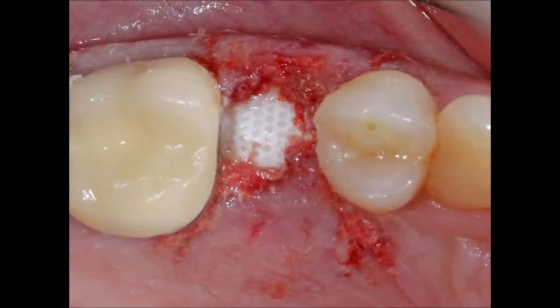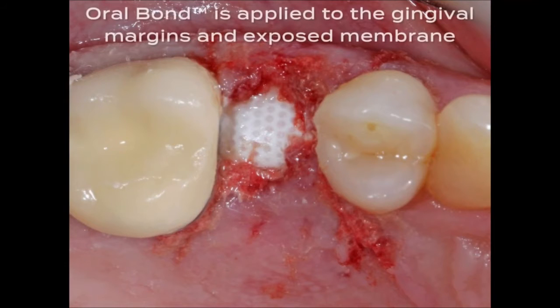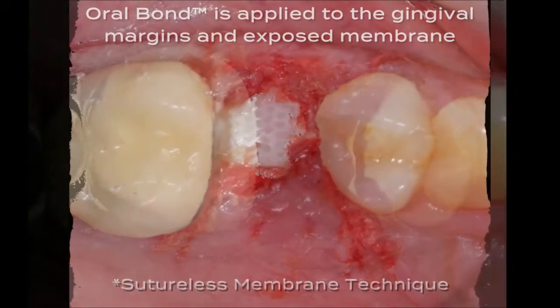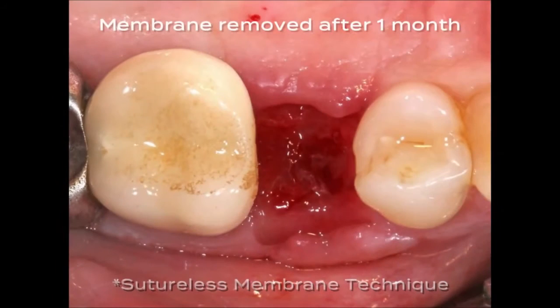After grafting, cover the material with a dense PTFE membrane. Do not use animal or human membranes as they will compromise the results of this material. Remove the membrane after 1 month, exposing the soft connective tissue of mineralizing bone.